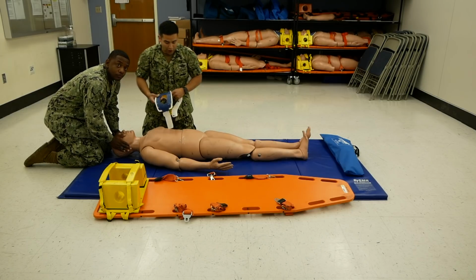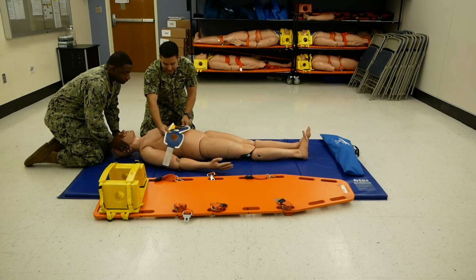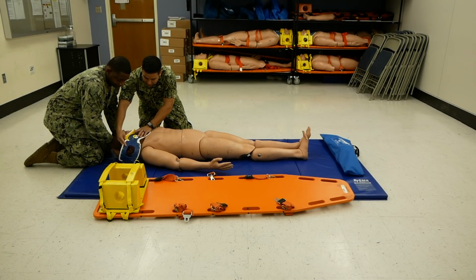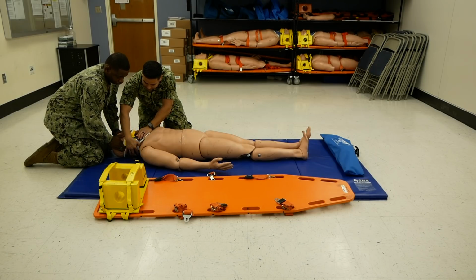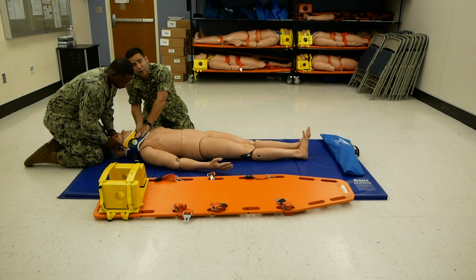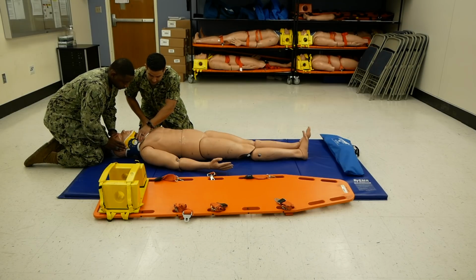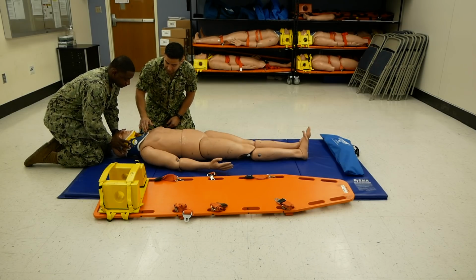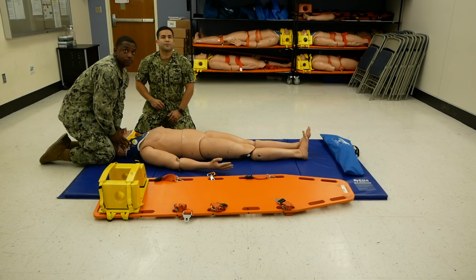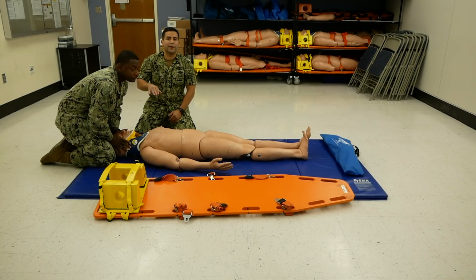On applying the cervical collar, you want to go ahead and slide up the patient's sternum so it stays midline. Place it under their mandible, and then slide the back of the C-collar around the back of their neck. My assistant will adjust their hand to grab the C-collar and help me hold it in place. And then you Velcro it secure. The C-collar should be resting on the sternum and under the mandible. You want to also verbalize that only a medical officer can remove the C-collar.